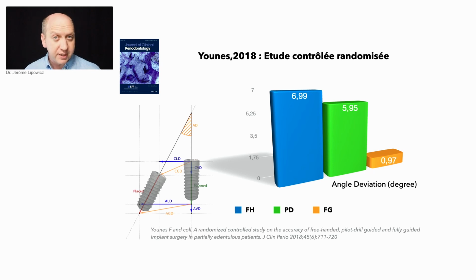So in summary, depending on the bone density and the implant design, we can still have strong deviations even if you proceed with the whole sequence of drilling and not just the pilot drill. There is therefore a real benefit in using guided surgery in your immediate implant placement strategies. So sure, we can use angulated abutments, of course, and angulated screw channels, but in terms of biomechanical considerations, why not have a nice and easy implant axis with guided surgery, whether static or dynamic?